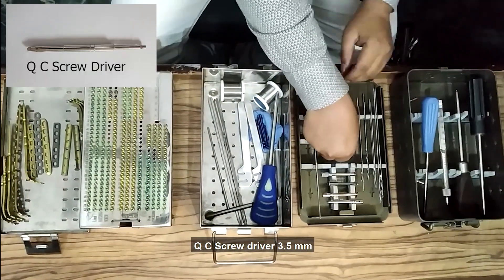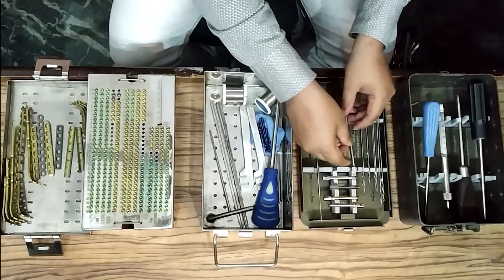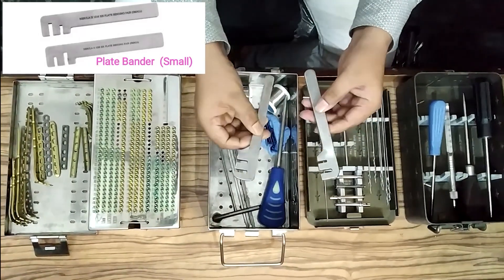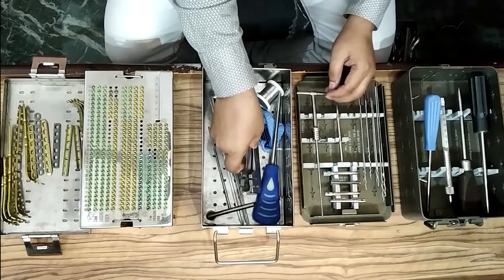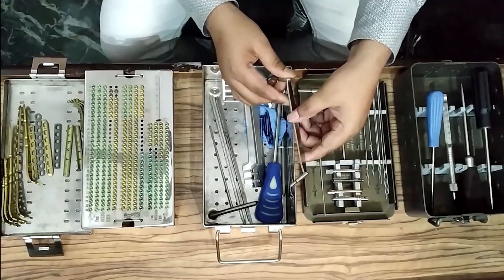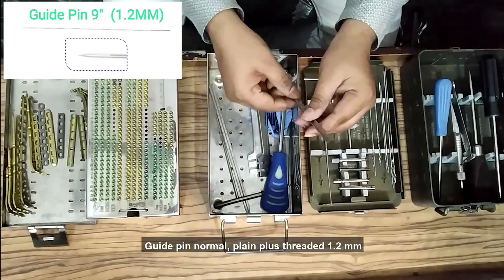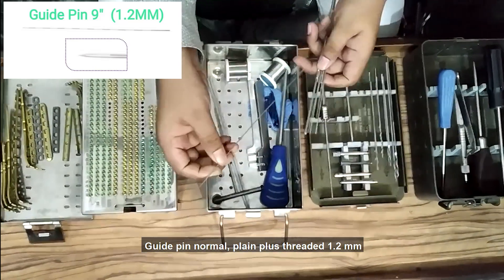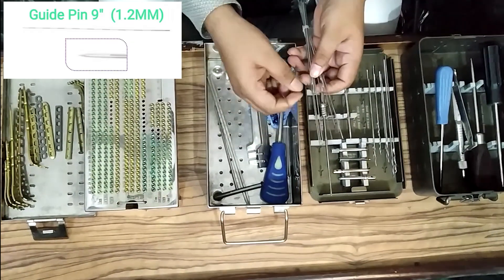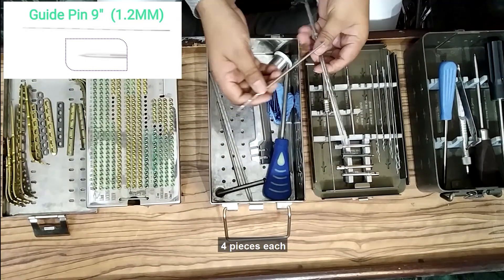QC screwdriver 3.5 mm. Plate bender small, one pair. Drill guide 3.5 mm. Guide pin — normal plain plus threaded — 1.2 mm, 9-inch in length, four pieces each.